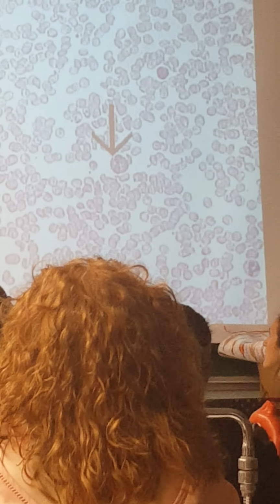Alright. Too fast. So what's this? Neutrophil or lymphocyte? Neutrophil. What's this? Lymphocyte. This giant one is a monocyte. See how it's really big? That's a monocyte. Okay, neutrophil, lymphocyte. Whoa, this is squashed and weird. I don't know what that is. But that's a neutrophil.